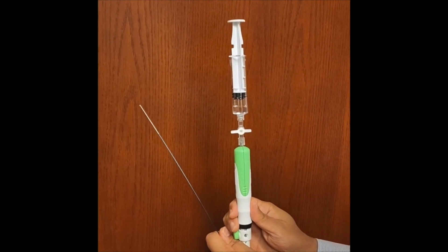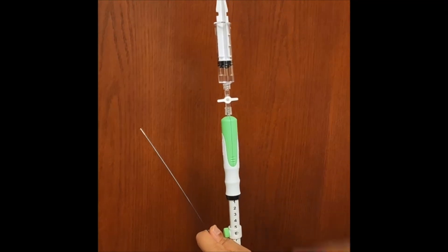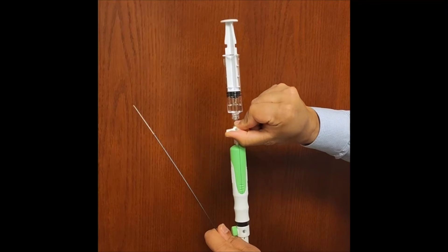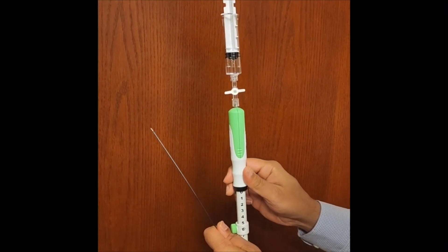Withdraw to your reset position. Last actuation: suction on, throw, suction off. Withdraw from the liver under Doppler flow.